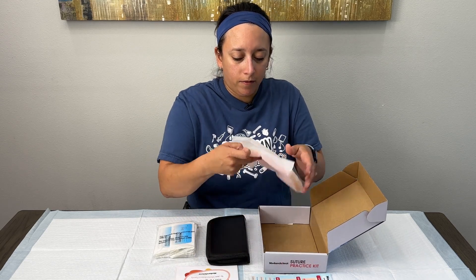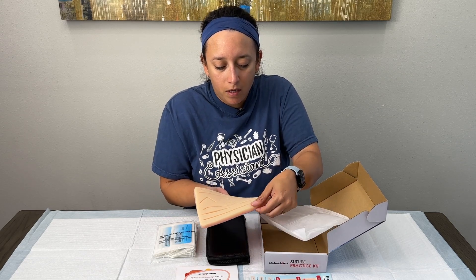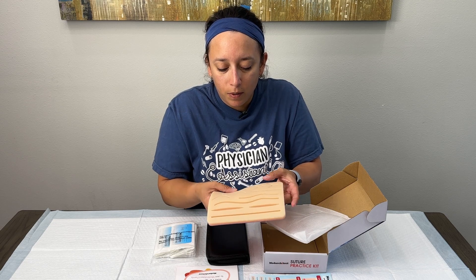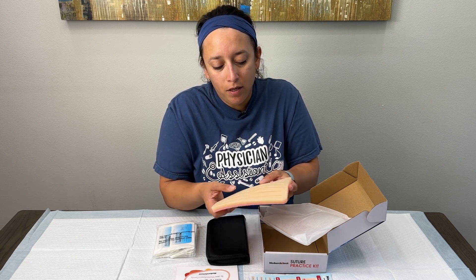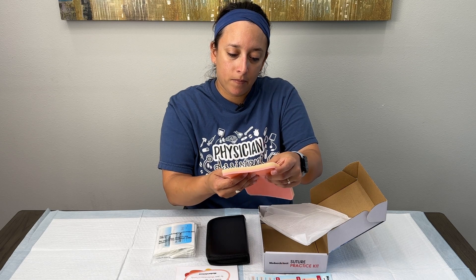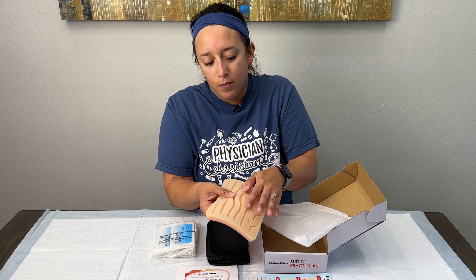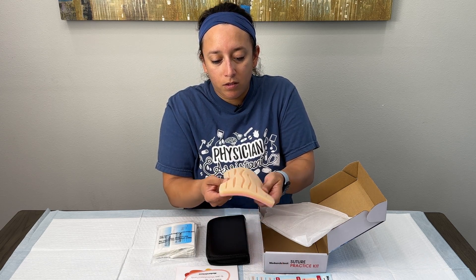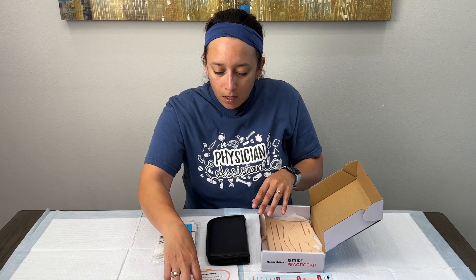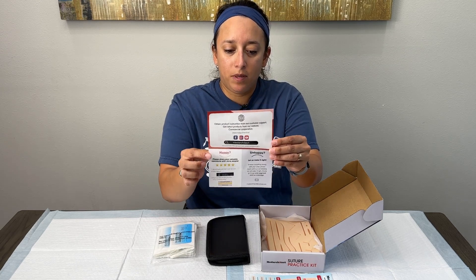First off, we have a silicone pad, and this silicone pad has several different pre-cut lacerations of different sizes. It has some that you can practice corner stitching, some smaller ones that are a little more gapy, and certain triangular wounds. It really is a nice array of lacerations to repair. When you look inside, it doesn't necessarily delineate the epidermis and dermal layers, but it does look like a solid silicone pad.